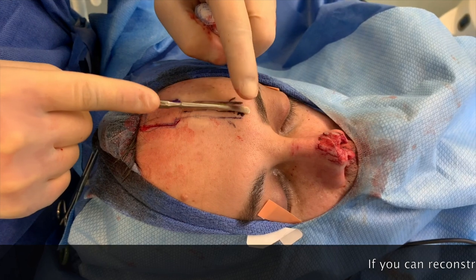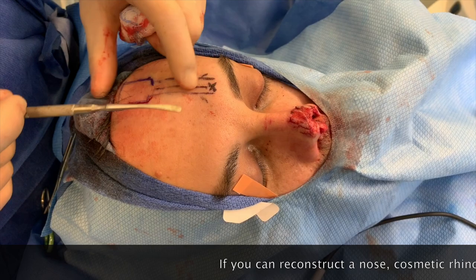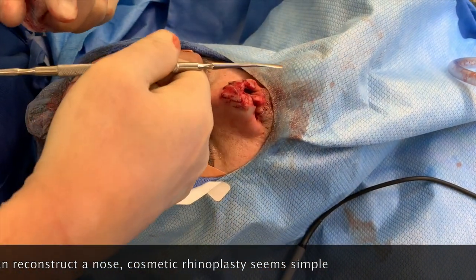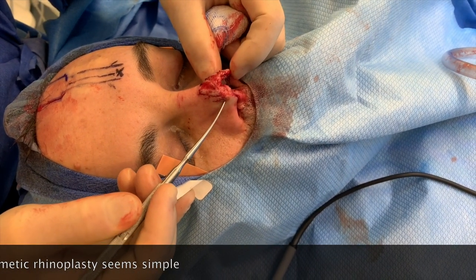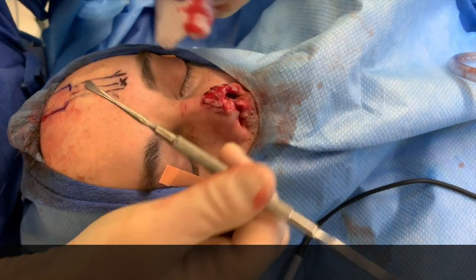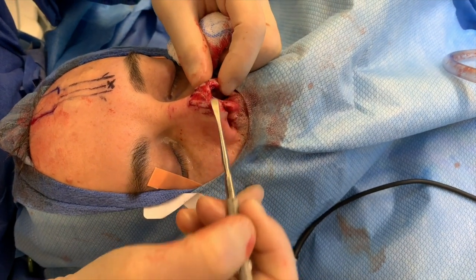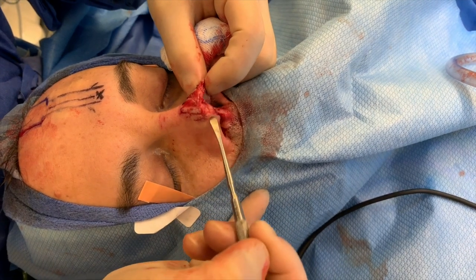The easy way to think about it is it's going to be based on an artery that starts here, and we're going to rotate this pattern around so it's going to cover the nose. We'll put the support cartilage grafts, and then this flap is going to cover. Honestly, it's not going to look all that great to start out with, and it's going to remain attached. In about three weeks, the tissue we bring over will get new blood supply from the surrounding tissue.